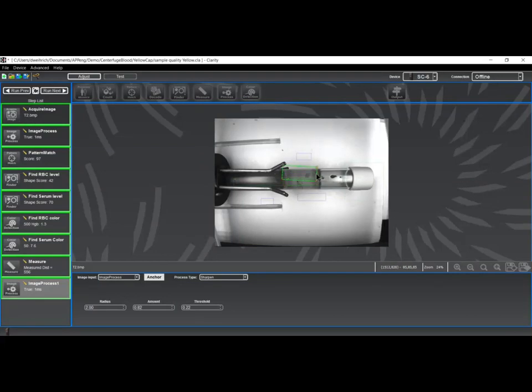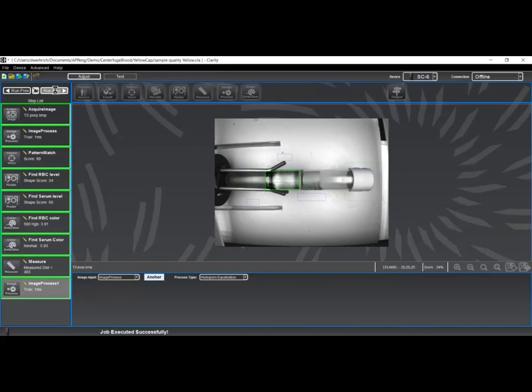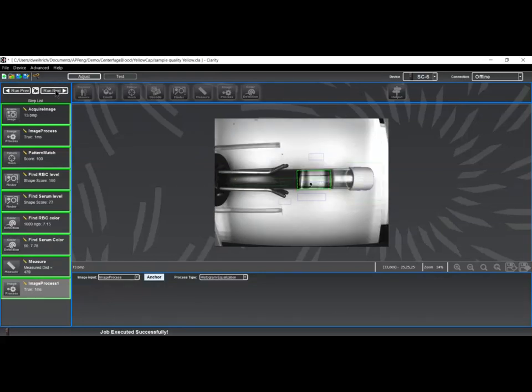And I'm going to measure based on the majority of the serum area. We're going to do the histogram equalization. You can see this enhances the contrast within that area. It is anchored to the serum level, so as I do this for each one of the samples, you can see it follows the serum area.